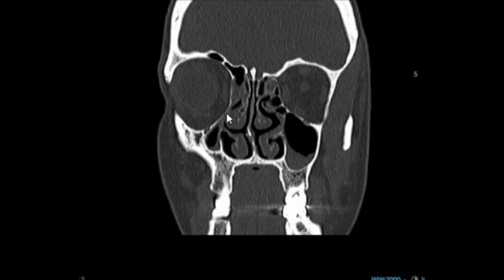After going through that, if you're using a suction or a debrider, you are directly exposed to the medial and the inferior wall of the orbit. And imagine if one starts using a 45-degree Blakesley or micro debrider, the next thing will be, boom, orbital fat. You don't want to have that.